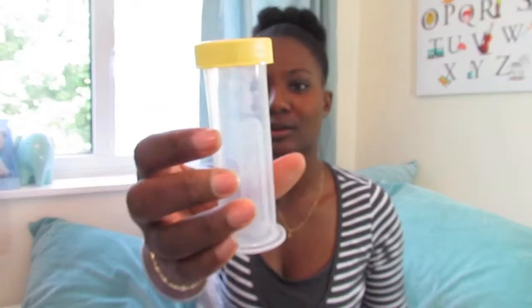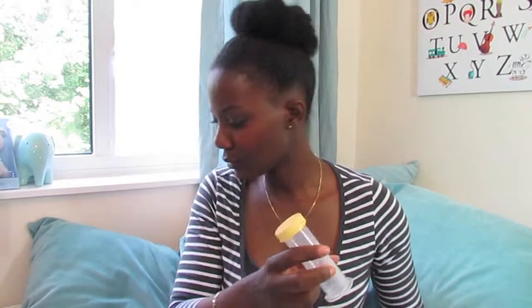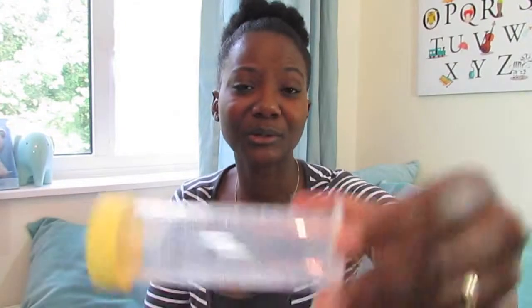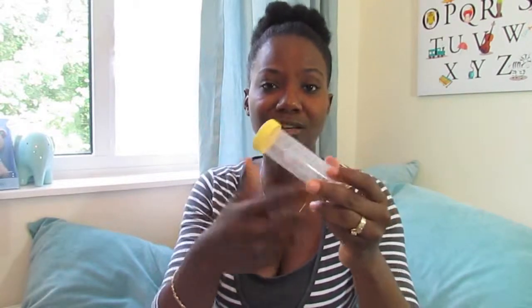It also comes with a tray and some smaller bottles, which take up less space. These are about 80ml. The only thing I'll tell you — it has a label area where you can mark with a marker. Maybe I used the wrong marker, but it doesn't wash off really well, so just make sure you use the right marker. It has that feature where you can label it as you use and then relabel.